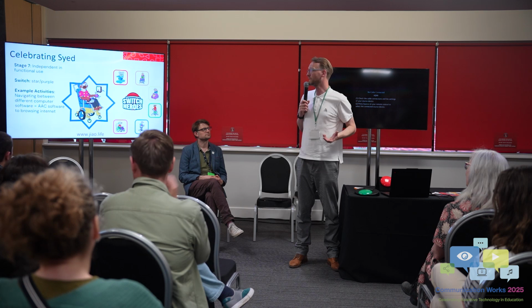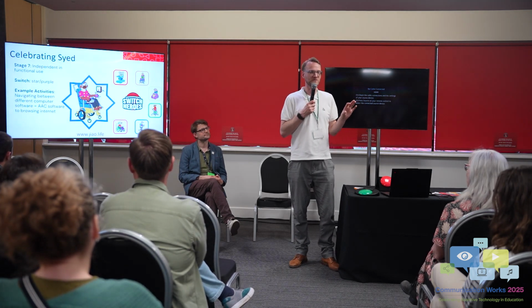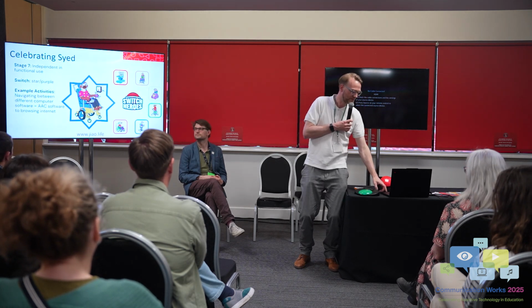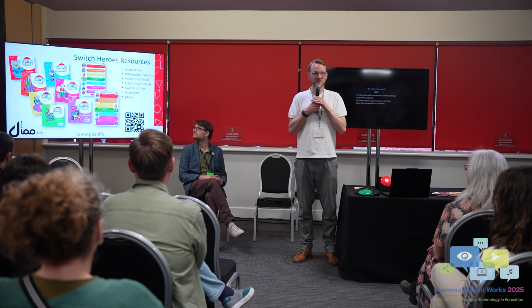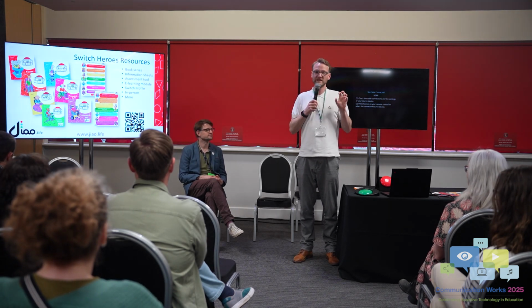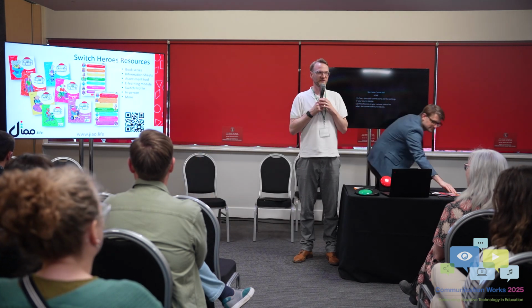And then we get to the seventh stage, independent in functional use. So this is where you're using switches for communication. You're then going out of your communication device and your software and going to play games, or you're controlling your lights in your environment. To support the 7 stage switch development, I've created 7 social stories. So this teaches the child, the user, about switch skill development. It also has a byproduct.